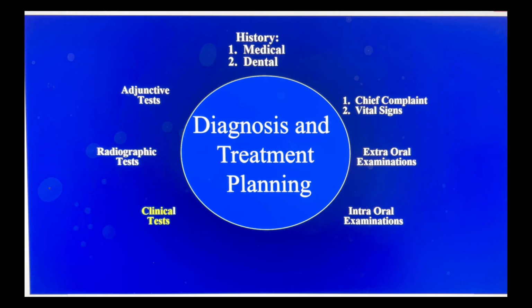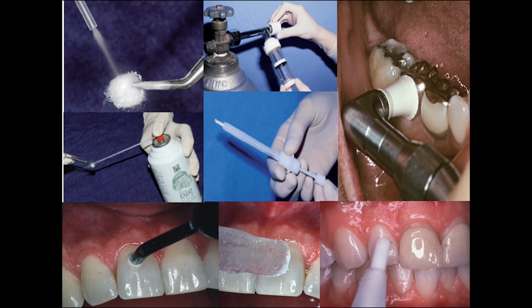Pulp sensitivity tests can also help practitioners to distinguish between odontogenic and non-odontogenic pains. Currently, there are different pulp sensitivity tests to evaluate the status of pulp tissue. The most common tests are thermal and electric pulp tests.